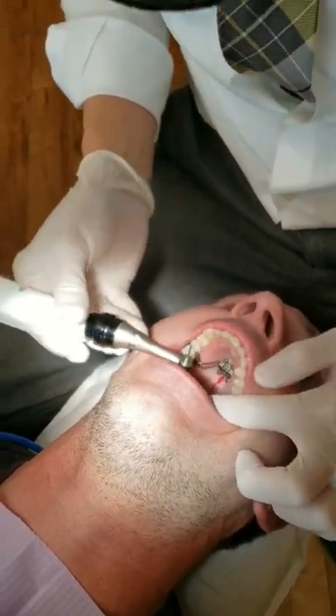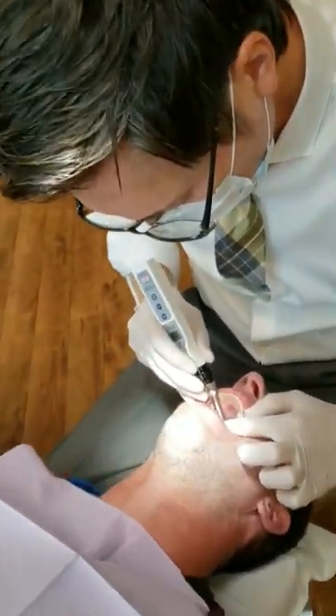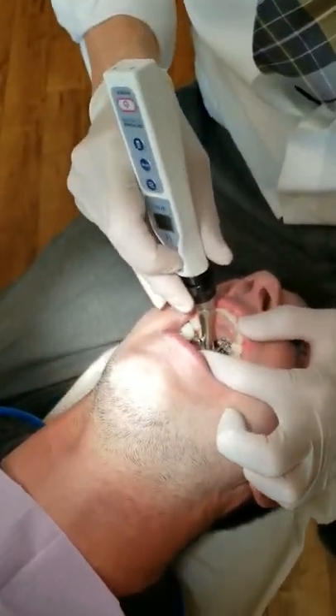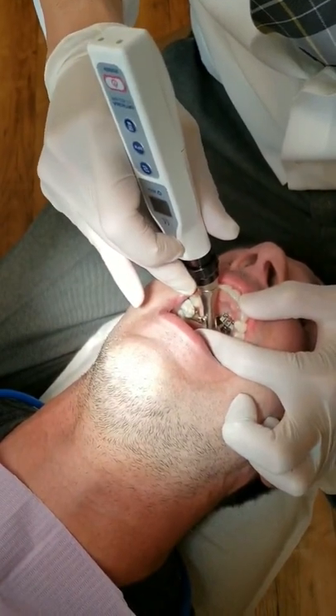Now we've got three holes so far. How's that feel? No pain? Excellent. We're going to follow the midline and go to the front. That's a very high palate.